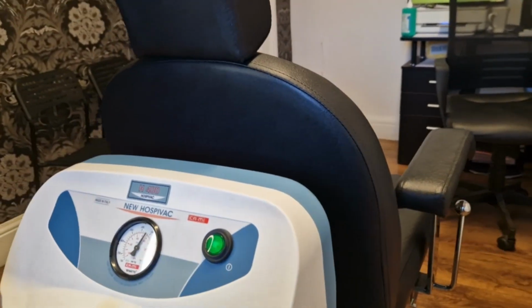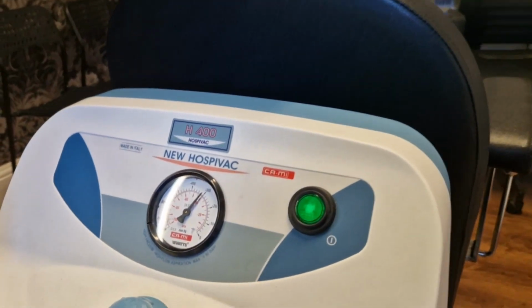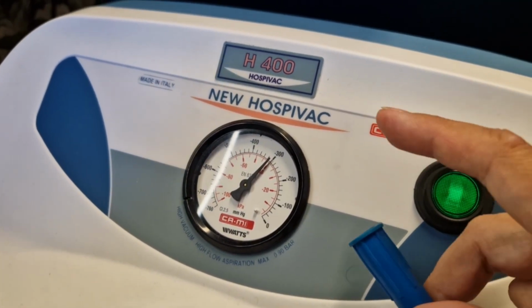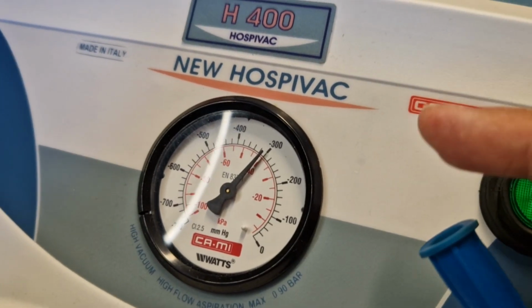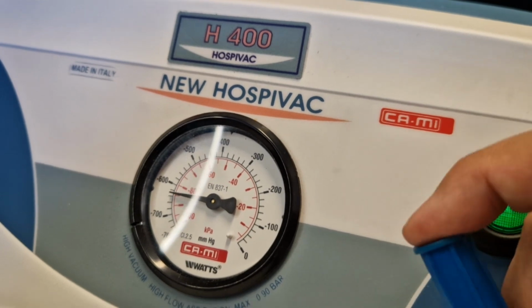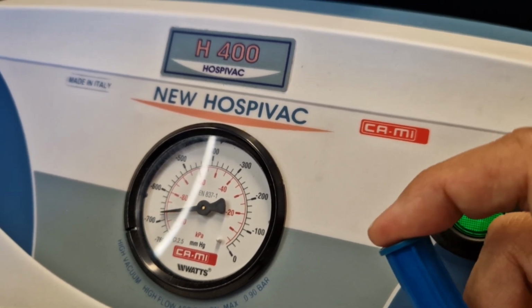And you'll hear that noise. Now what you'll notice, when I'm not moving sometimes, is to wait for the power. So let me put that next to it there. You can see that power there, whereabouts it's hovering. When I close it up, you see it goes up. So that means the power is increasing because you blocked it.